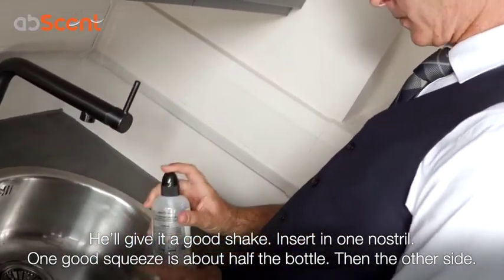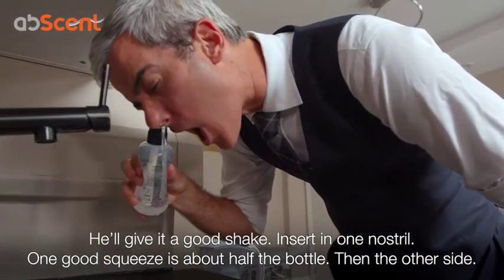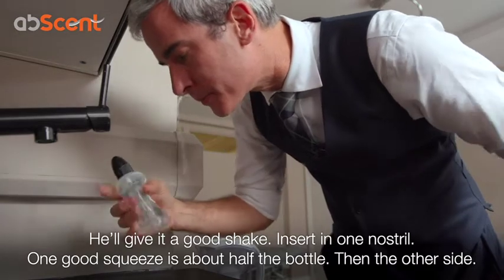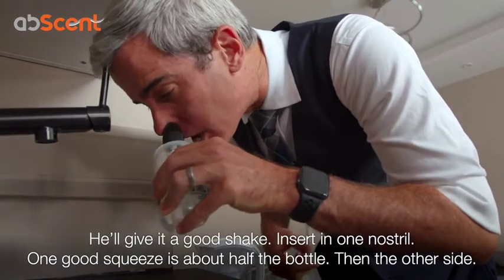And now he's going to take a deep breath and insert one nostril. There it goes — it comes out the other side. One good squeeze is about half the bottle, and then the other side.